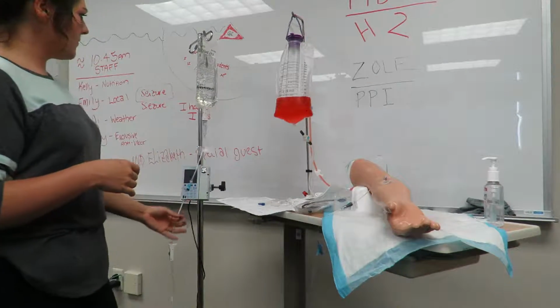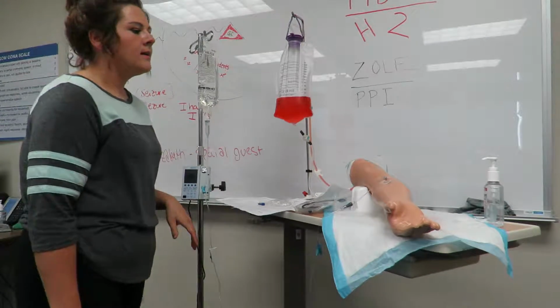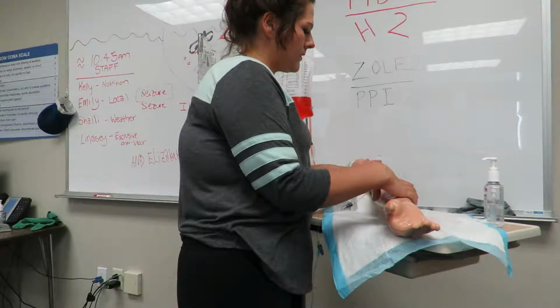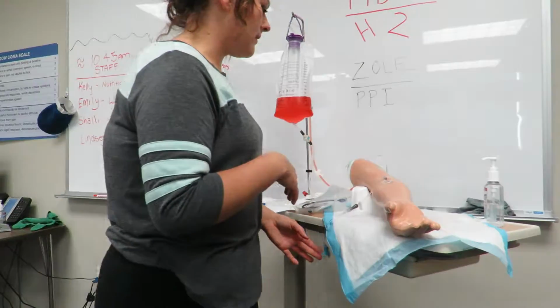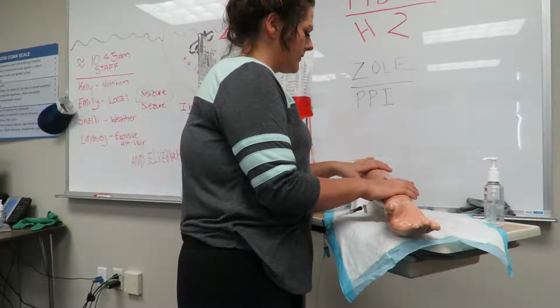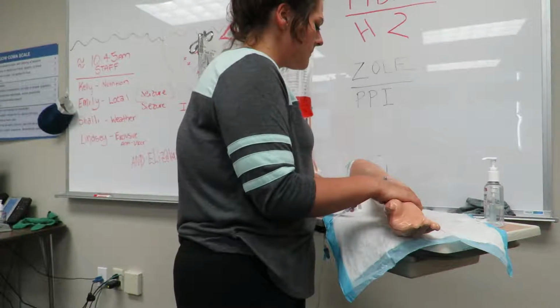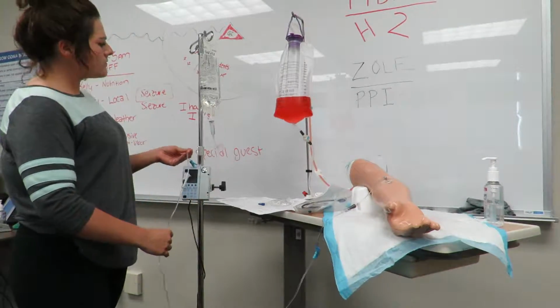And I'm just going ahead and seeing that your IV is currently running, it's active. I'm looking at your site here, and I don't see any signs of phlebitis, any redness, tenderness, swollenness. Does it feel okay, Joe? Okay, good. And there are no signs of infiltration. There aren't any cold swelling patches or anything hard. It's going directly into the vein. It's not infusing into the skin at all. So it looks good. And that was put in a little earlier.